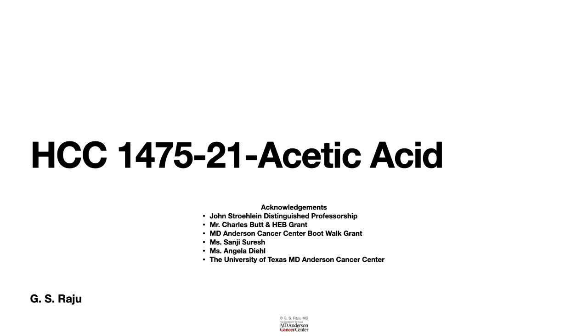Let us learn about the role of acetic acid in GI endoscopy.